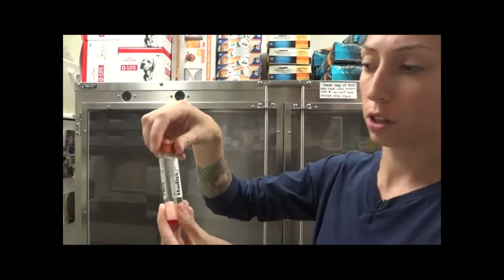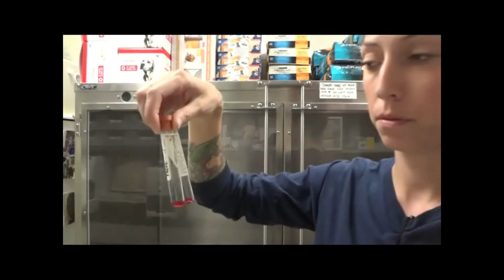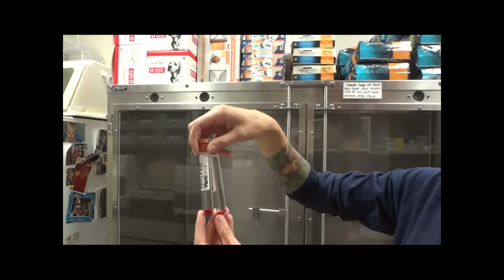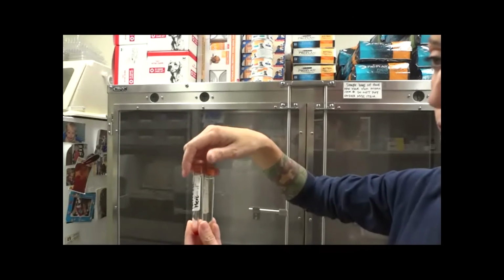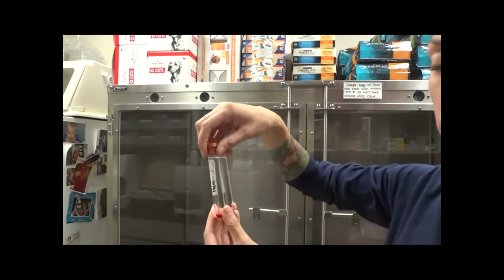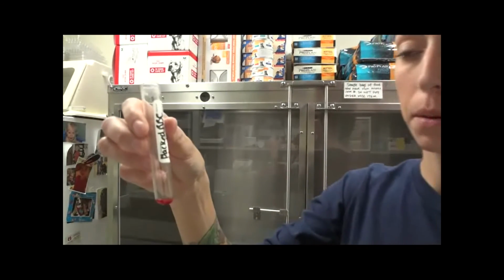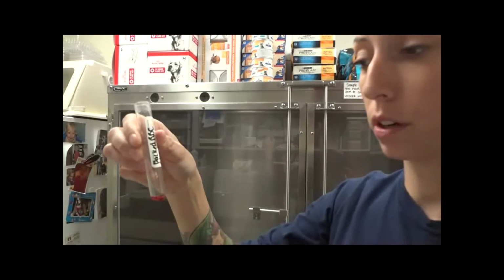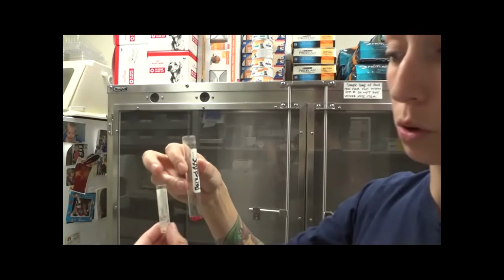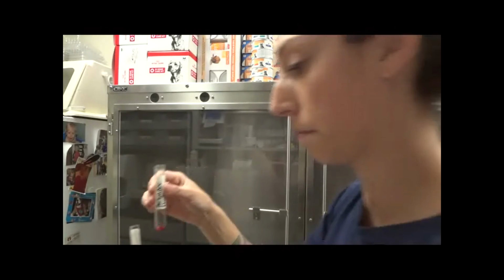Here is our first erythrocyte wash. We're going to do this 2 more times. So we've got our last erythrocyte wash done. We're going to remove the saline solution from the top, and this is what we'll use for the remainder of our cross match. So now we're going to take 0.02 mL of the packed erythrocytes and add it into 0.98 mL of sodium chloride solution.